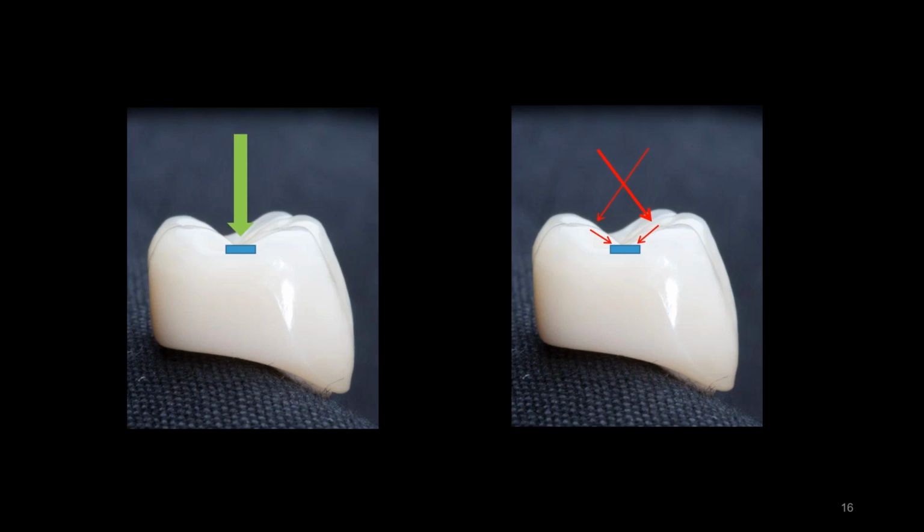If the bite's locked together, there's a hit and slide. The hit and slide's what's killing us. Again, the hit and slide's why I've been banging my head on the wall for the first 10 years of my career. It hits and slides into position because they were not able to pinpoint centric. So now on the left side of the screen, you have that little bit of wiggle room, that little bit of freedom to allow for compensation, okay?